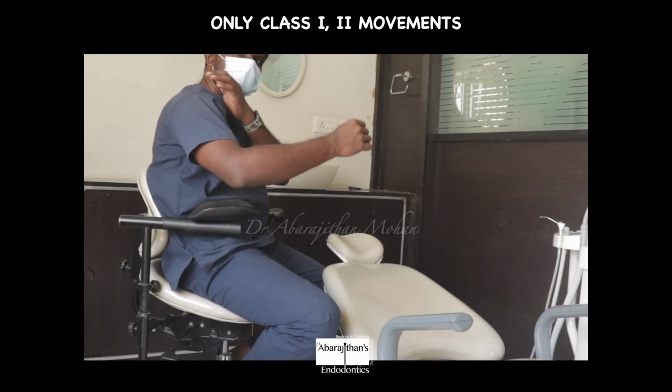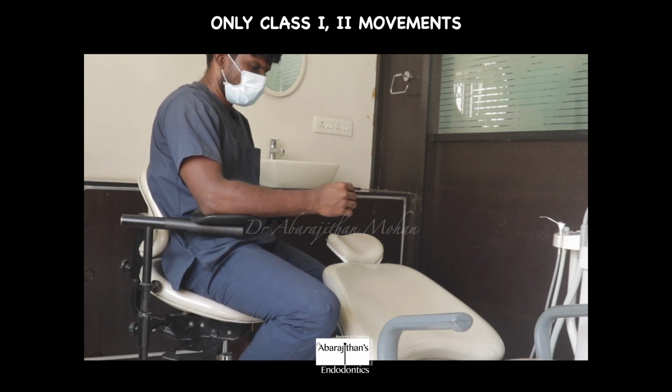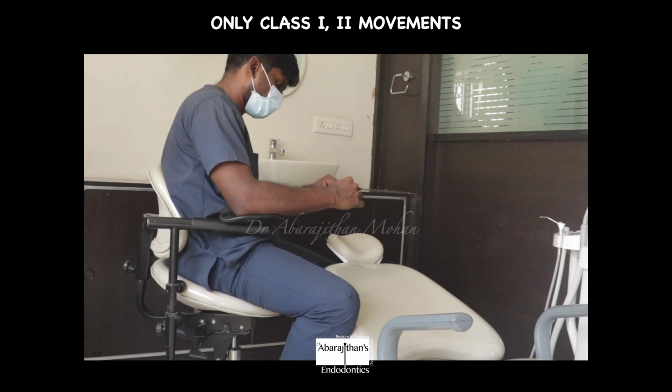As you can see here, once my elbow is rested and locked, irrespective of the type of treatment that I'm going to do, irrespective of the area that I'm going to work, be it maxilla or mandible, the movements are going to be restricted only to class 1 and class 2.